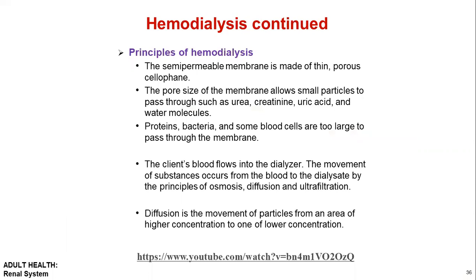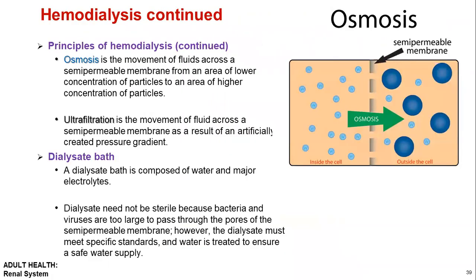So next here, the principle of hemodialysis. Let me read it. A semi-permeable membrane is made of thin, porous cellophane. So let me show you the picture. Like this, there are two solutions separated by a semi-permeable membrane, and this membrane has a lot of small pores.